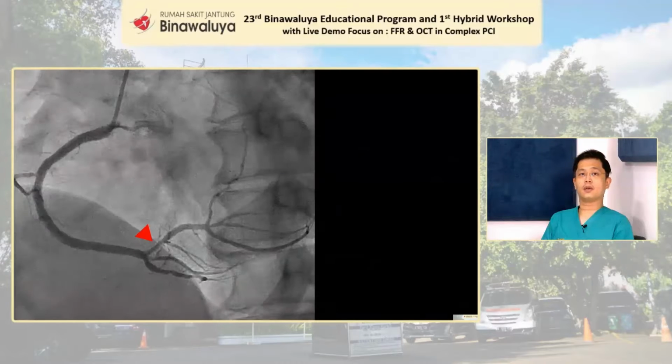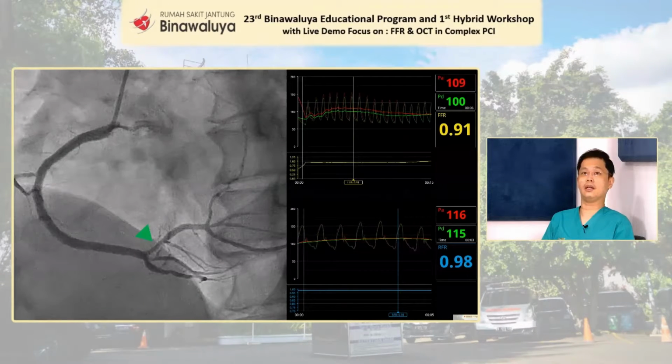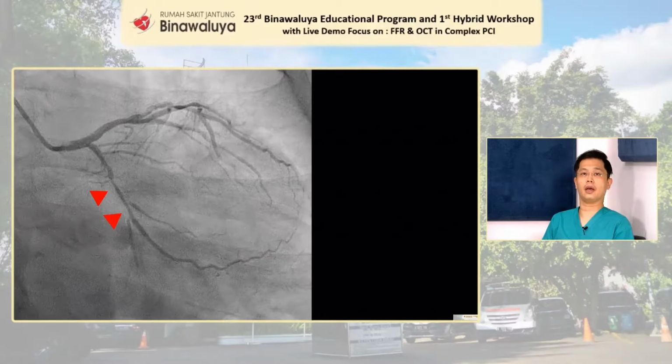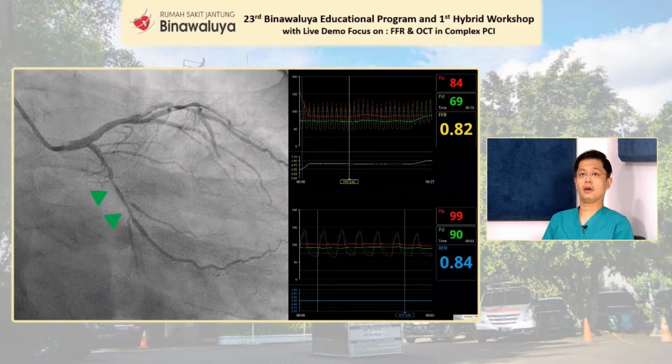So once again, this patient underwent a multivessel physiological assessment. This was clearly not going to be significant, and the lesion in the circumflex, which I frankly thought would be significant, turned out to be not significant. Here you can see some slight discordance. The RFR was 0.84, but the FFR was 0.82. And therefore, this is also a picture that you oftentimes see as to why it is discordant.